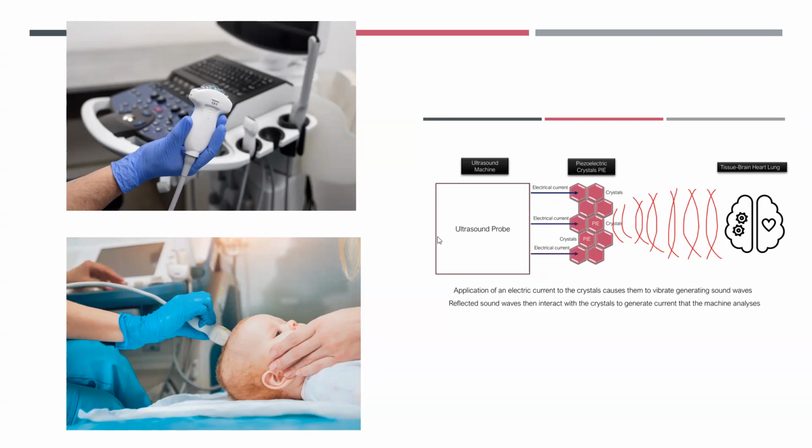But even in the brain, use a decent amount of gel and uniform application. If you can see my cursor over here, it's really important to have gel applied uniformly across the probe so that when you hit the fontanelle, you don't get what we call dropout, because of loss of contact, but also because of gel content not being good.